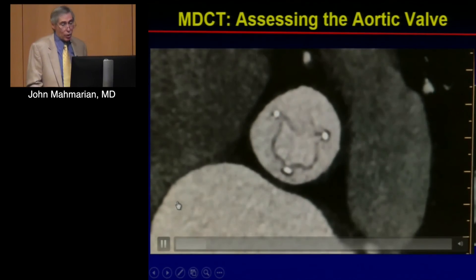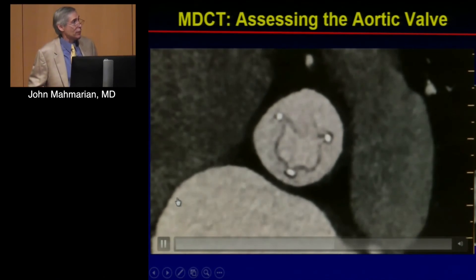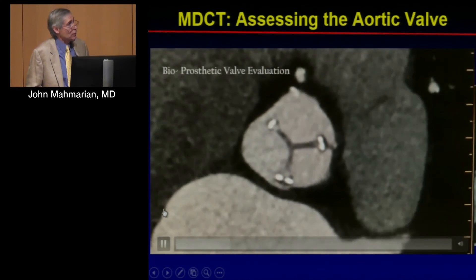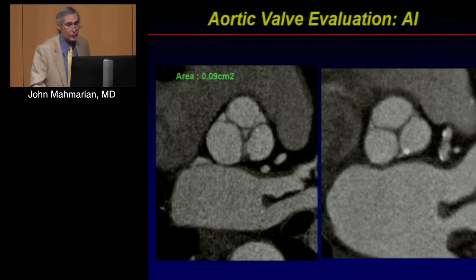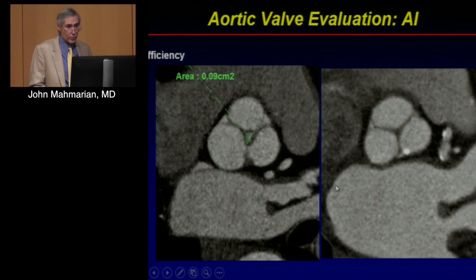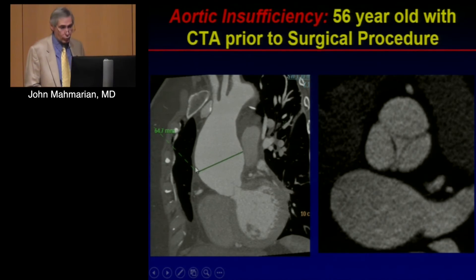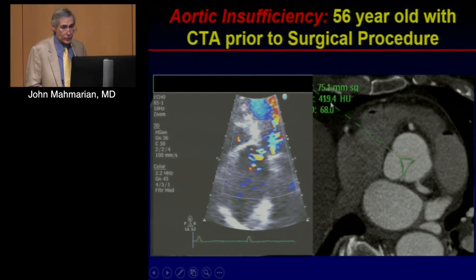We can also assess already-implanted valves. Here is a bioprosthetic valve demonstrating the high fidelity of CT images for both native and prosthetic valves. We assess aortic insufficiency in diastole by looking for gaps in the leaflets compared to normal valves. This patient had a very large aortic aneurysm with severe AI, and the effective regurgitant orifice area confirmed severe disease.